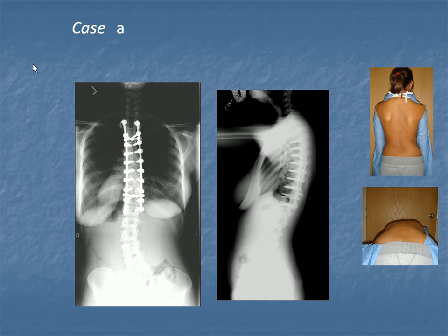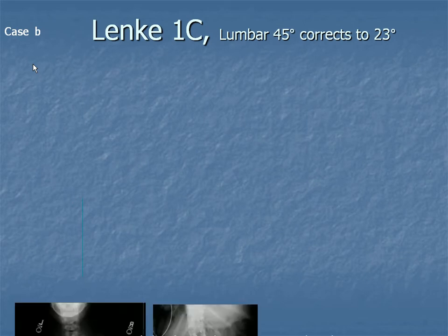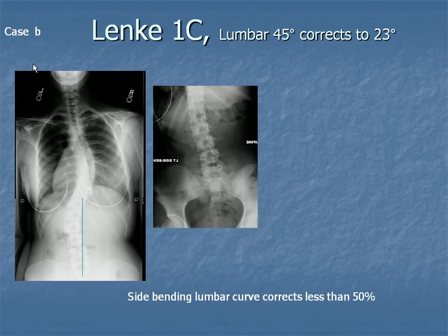It is important to look at the symmetrical waistline of the patient, because this patient is asking not to be shifted to one side. Another patient, the same story exactly: a 45-degree curve, side bending 23, so it is below the 25-degree marker for Lenke classification, so it is a type 1 curve. The central sacral line is beyond the apical vertebra, so it is 1C.